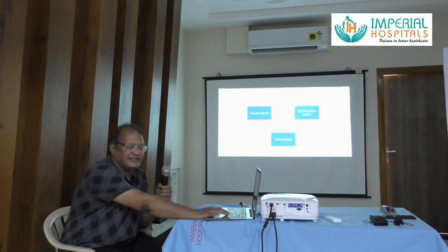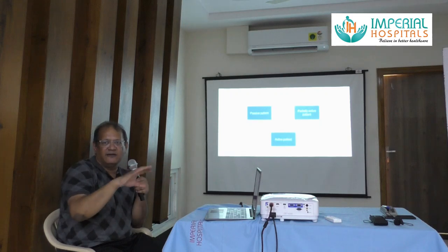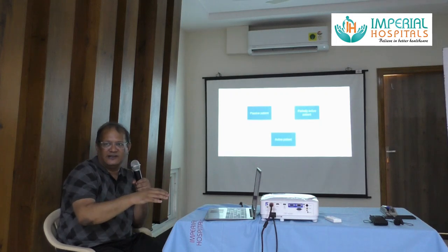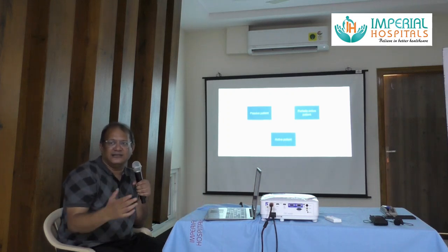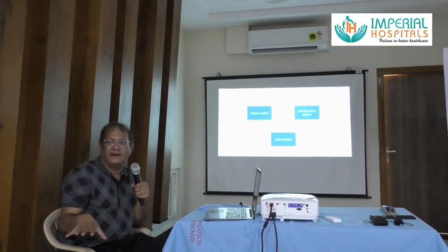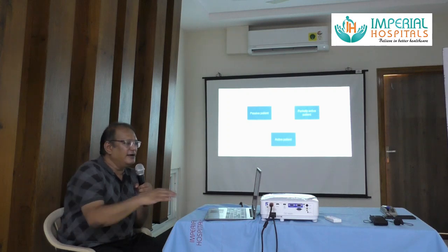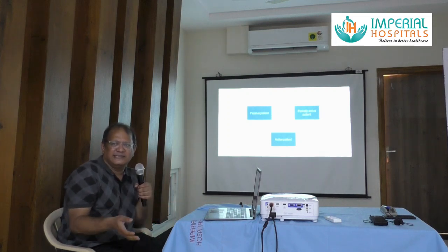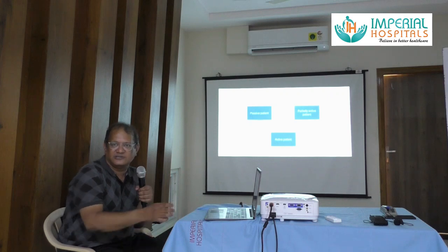So again, like I was saying, a patient is passive, partially active or active, and as the status of the patient changes, you can change from ACMV to SIMV to pressure support. If the patient is completely active, pressure support is much better tolerated by the patient than an ACMV mode. Partially active patients, you want some mandated minimum ventilation, so you can go for ACMV or SIMV modes. And completely passive patients, CMV ventilation used to be the gold standard, but right now ACMV is also used widely.